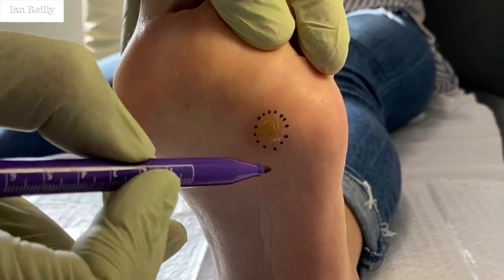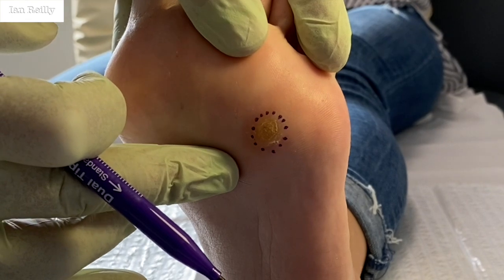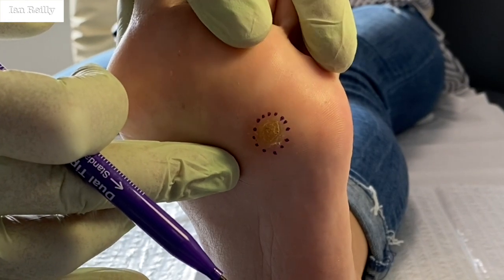I've talked on other videos about full thickness excision versus curettage, but I just think full thickness makes more sense for these.